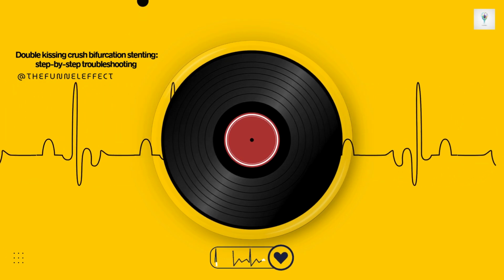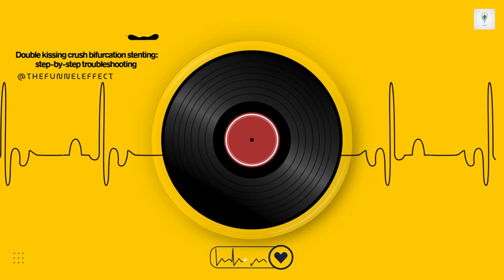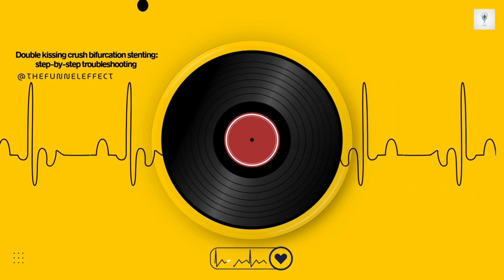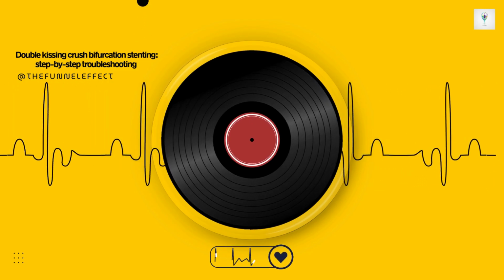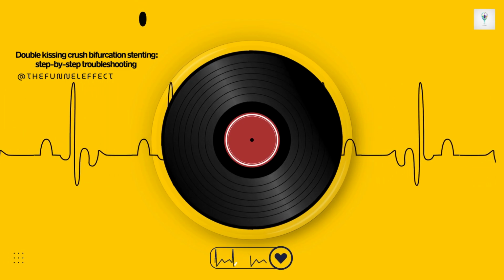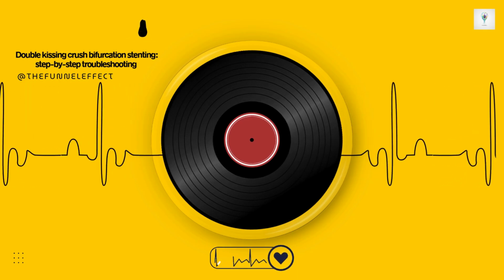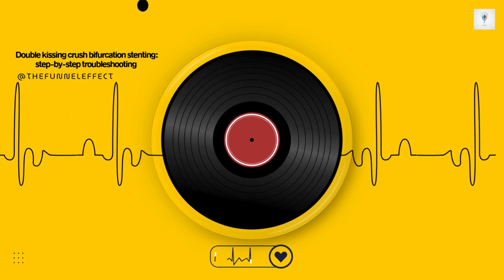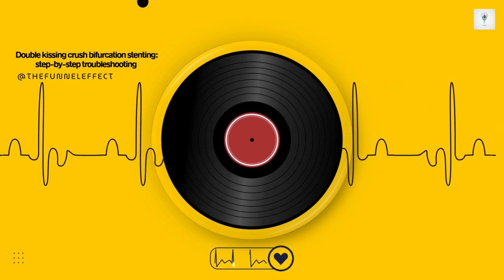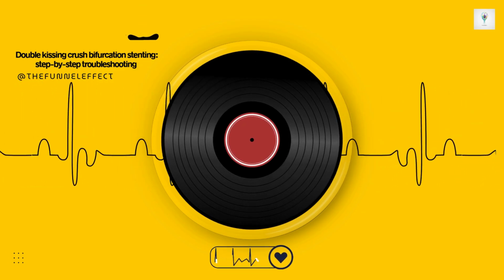The source mentions some pretty specific advanced techniques too, like the hairpin technique. How does that work? Ah yes, the hairpin wire technique. It's quite clever, especially for side branches that come off at almost 90 degrees or even sharper angles. You put a really big, exaggerated loop or bend near the tip of the wire. You then advance this whole loop past the side branch opening, down into the main vessel. Then as you gently pull the wire back, that big loop catches on the carina, the divider, and sort of springs or pops the wire tip sideways into the side branch ostium. It uses the vessel's own geometry to help you make the turn when direct steering fails.